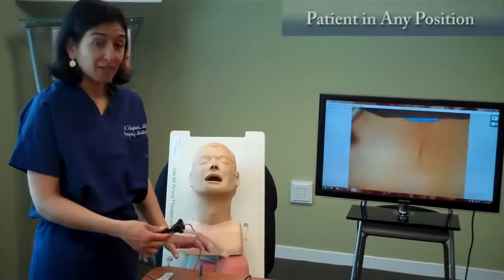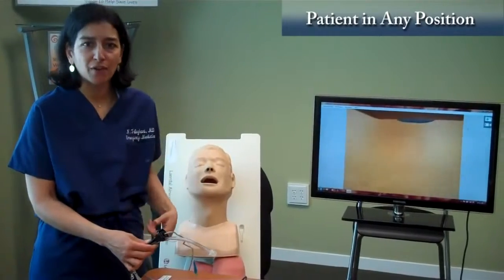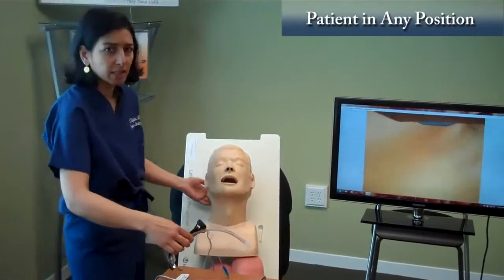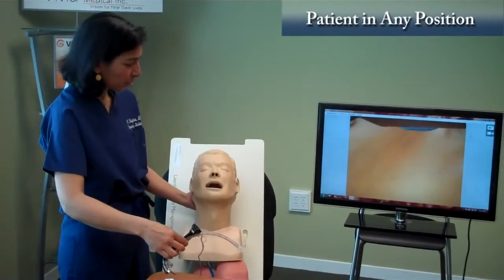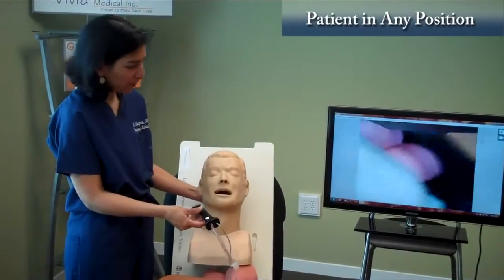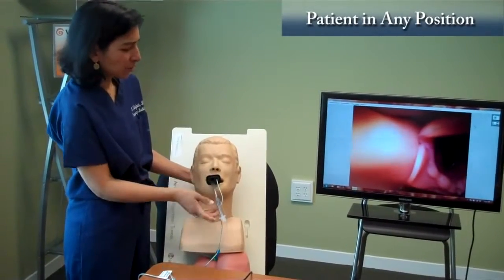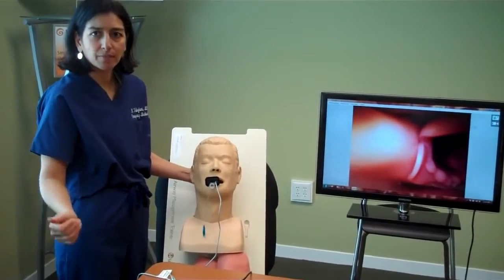So one of the other pearls of this device is that you don't necessarily have to be at the head of the patient with the patient supine in front of you. You can use Vivid Trac to intubate a patient in all sorts of positions. Let's simulate a patient seated in a car seat. That's a patient that's been involved in a motor vehicle crash, or a seated patient that you want to intubate. You can just come to the side of the patient, either put your hand behind their head or put a pillow behind their head, and you can guide the device right into their mouth, and there you have it. And once you see the cords, you do the same thing. You just take the ET tube and you push it right in, and you've now intubated the trachea again.